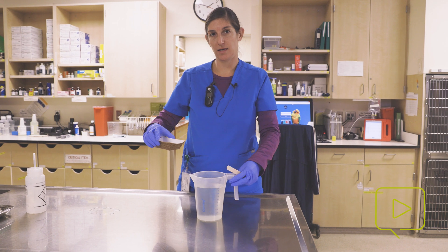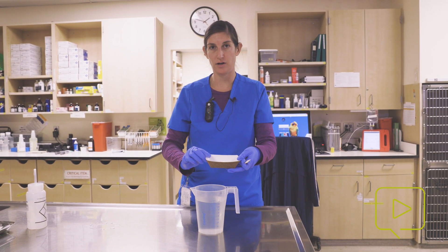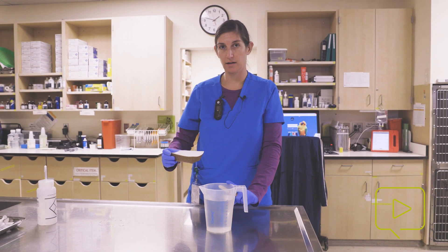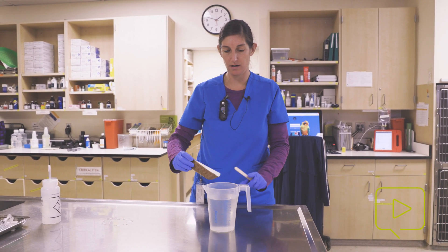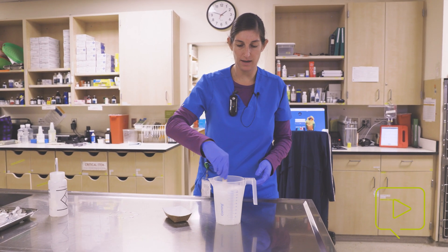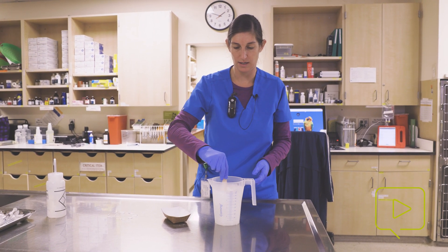We're going to continue making our stock anesthesia solution. This is our 10 grams of tricaine measured out into one liter of the fish's aquarium water — so this goes in here. It comes to solution pretty quickly, so you just need to stir it together.